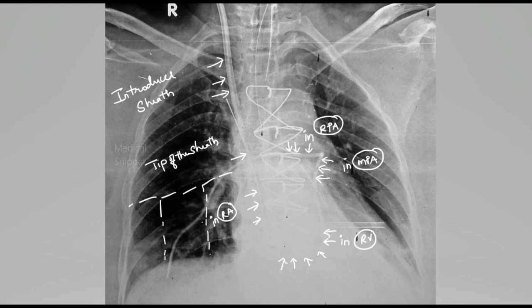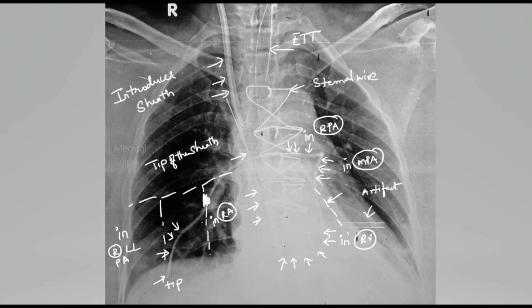The PA catheter should not cross the junction between the medial and middle third of the lower lung zone. In this case, it has crossed this junction and the tip is lying in the right lower lobe pulmonary artery branch. This mandates withdrawal of the catheter to a more proximal position, as balloon inflation in this position can cause injury to the branch pulmonary artery. One can also note other markings in this chest X-ray.